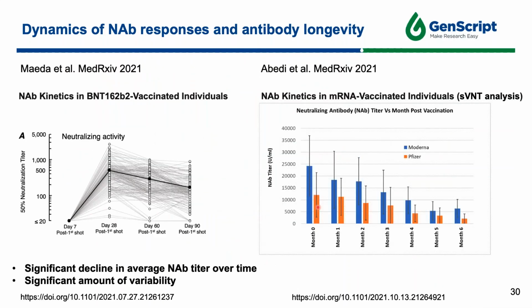Many studies also investigated the neutralizing antibody kinetics among the vaccinated. First, I'm going to share the results for the mRNA vaccines, and later I will also be sharing the results for inactivated virus vaccines. As shown in this study that is now in preprint, the neutralizing antibody kinetics in the Pfizer vaccinated individuals are investigated.